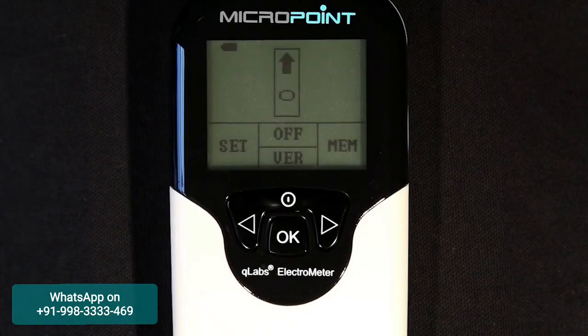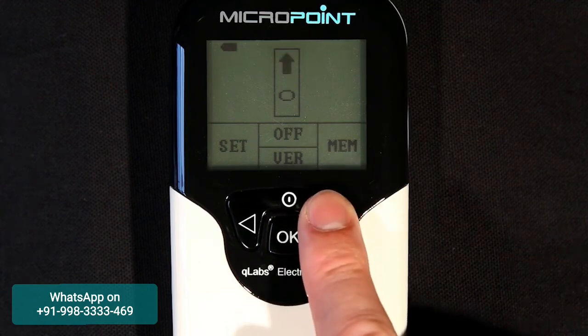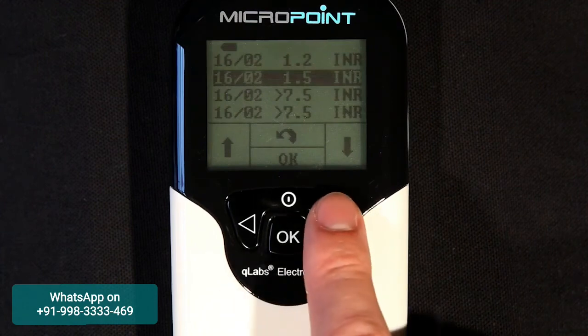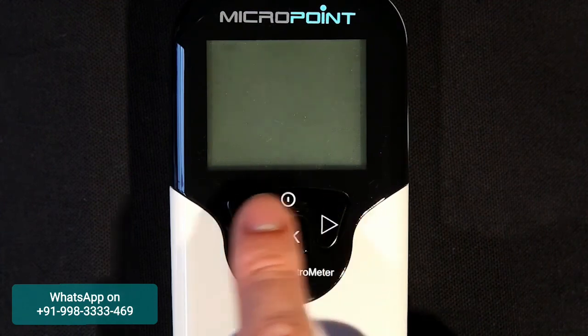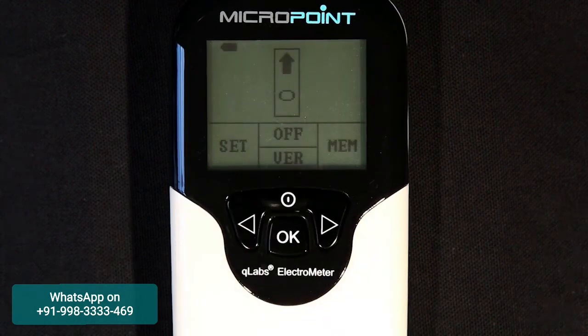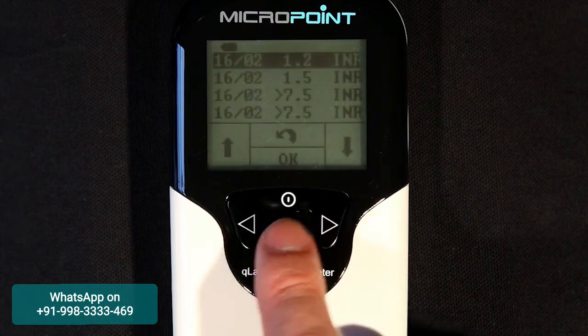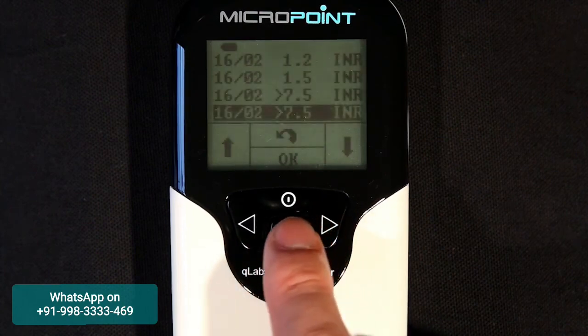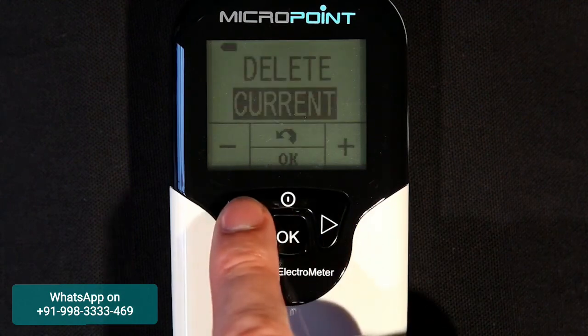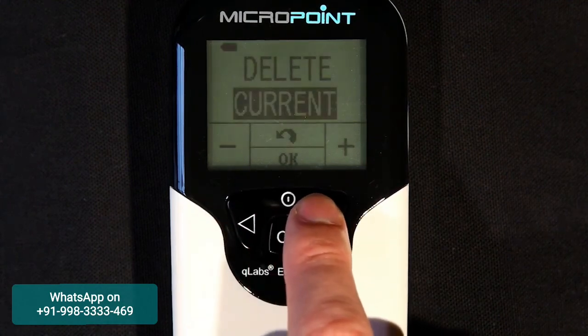To review results previously tested on the Q-Labs Electrometer, press the right button to enter the memo mode. The plus button will scroll through the page of results. To return to the test mode, press the return button, or to view the detailed information of a test, highlight the desired test and press the OK button. Press the menu button to delete the result currently being viewed, or all the stored data.